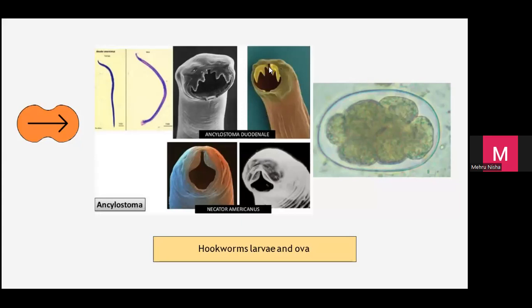If you really can see this, then you can tell either duodenale or americanus. The only thing is cutting plate dia different sikit. That's the difference. Okay, but this one, case dia agak teruk. I read in Indonesia also the rural children memang they have a lot. Tapi kami di Malaysia kita punya problem memang orang asli kita ialah Ascaris dan Trichuris. Ini kurang sikit.